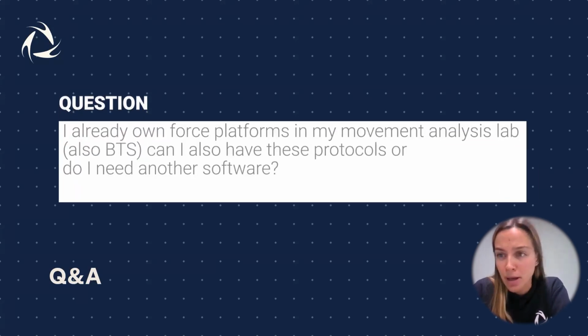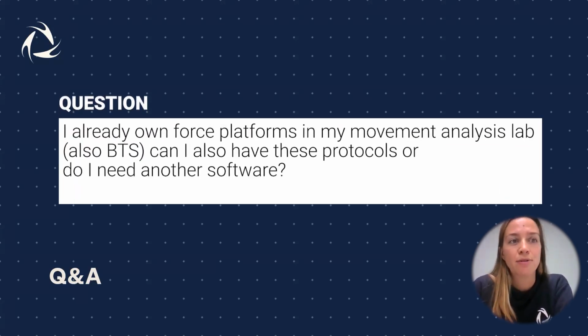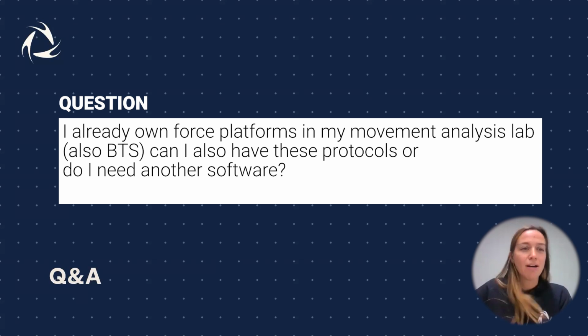Here, someone is asking first if clients or people already have force platforms in the analysis lab, in their own gait lab or sport lab, also BTS. It is possible, of course, to have our new updated protocols. You just need to ask your sales manager of reference for the market area of interest, and we will send you the possibility to download all our protocols, and also to do upgrades if you want.